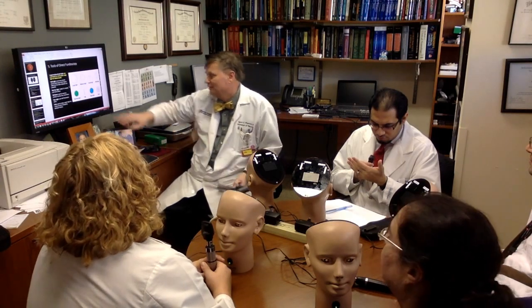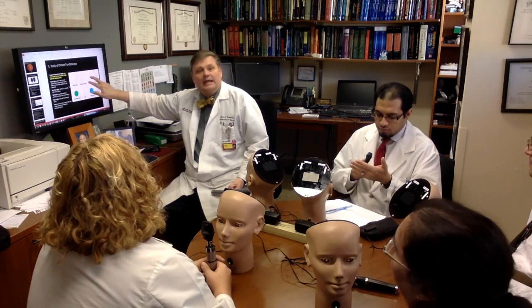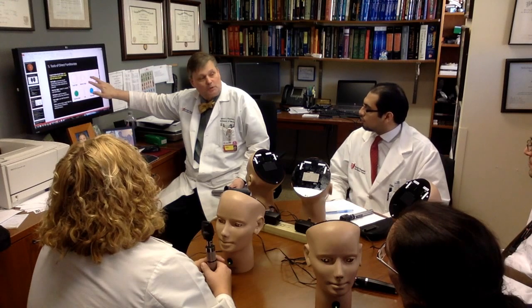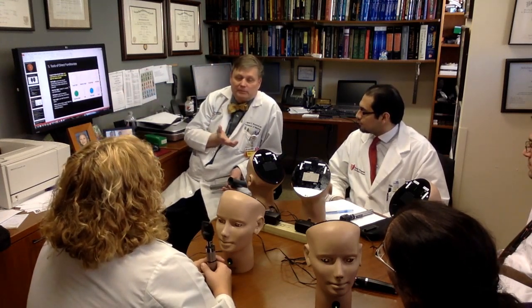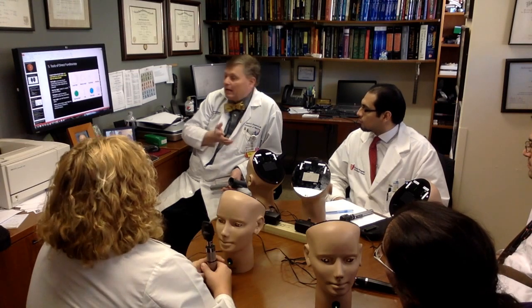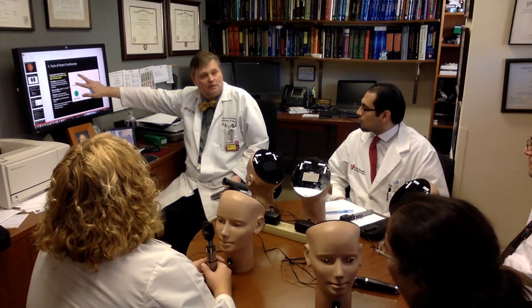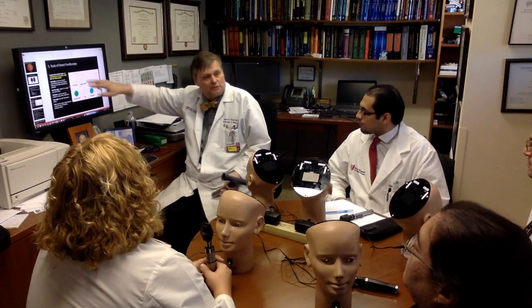Here's the bottom line. You want to use the large circle or the small circle. If the pupil is small and not dilated, use the small circle, all right? Because if you put too much light on them, it's just going to make the pupil constrict more. However, if the pupil is dilated, especially pharmacologically dilated, you want to use the larger light. That's what you want to do, okay?